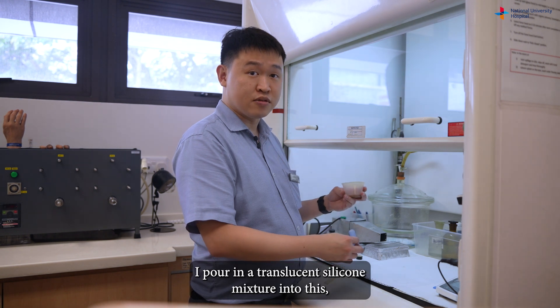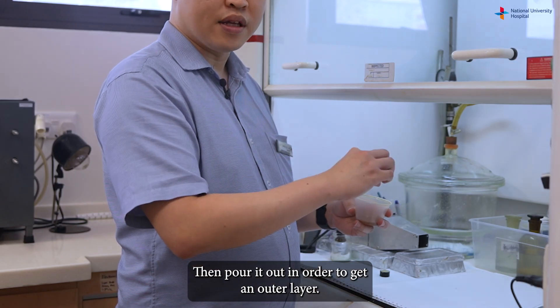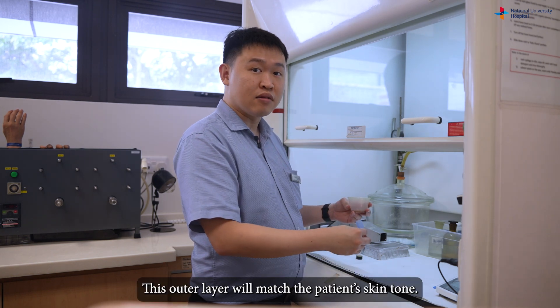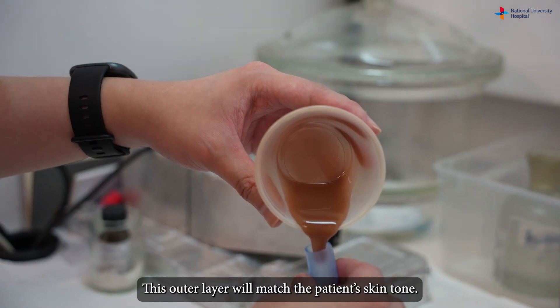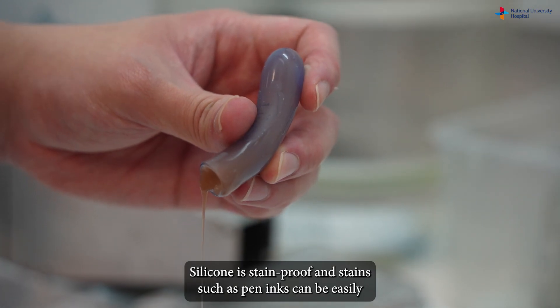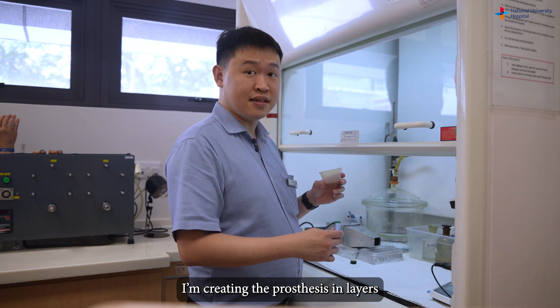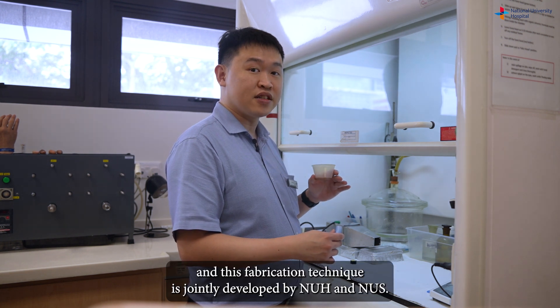Next, I pour a translucent silicone mixture in, then pour it out in order to get an outer layer. This outer layer will match the patient's skin tone. Silicone is stain-proof — stains such as pen inks can be easily washed off with soap and warm water. I'm creating the prosthesis in layers, and this fabrication technique was jointly developed by NUH and NUS.